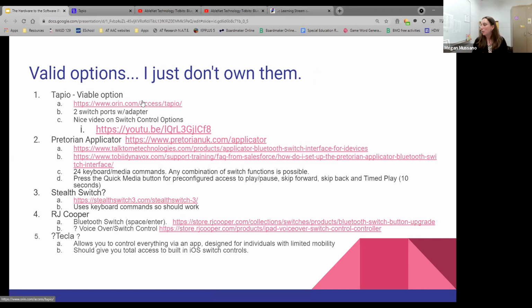Someone asked about students with CVI. Like, I would definitely turn the click on so that they know that they're scanning through. You could also turn the speech on so that they can get more feedback. One setting I wanted to mention, the very last thing she talked about was those custom gestures. She did a 2-finger swipe. You could draw a star. You could do a tap tap in many different places.